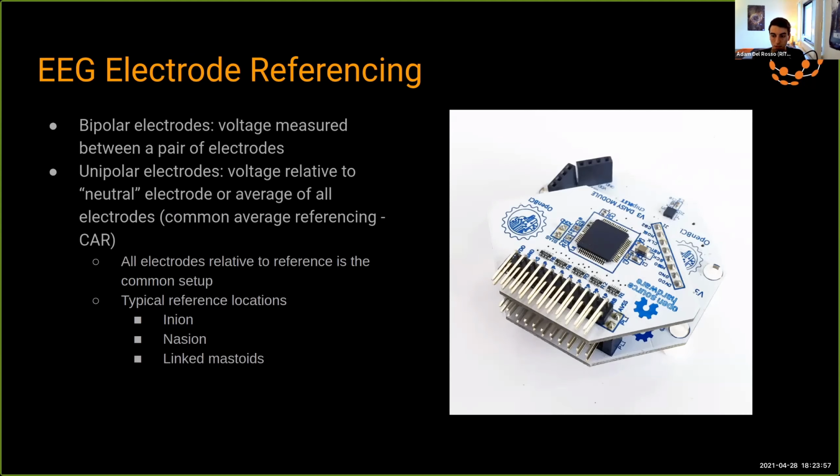This is a limitation of the low energy Bluetooth dongle. So this is a wireless board, and that's the USB dongle that gets plugged into your computer. They do have a Wi-Fi module as well, if you wanted to use that instead, and then you can get up to the max that the chip is actually able to handle, which I believe is 1 kilohertz.